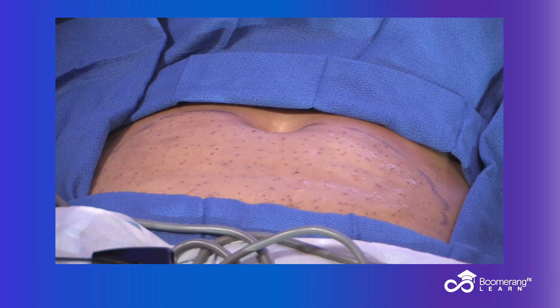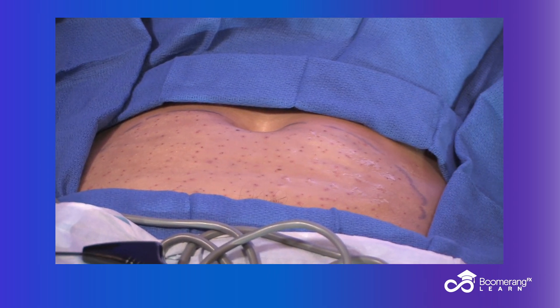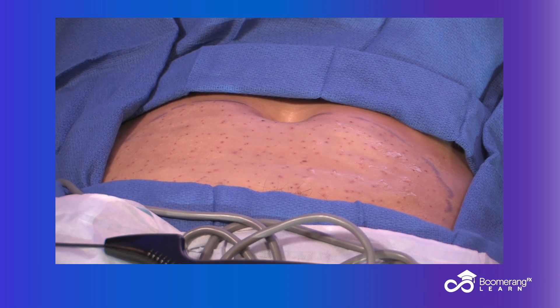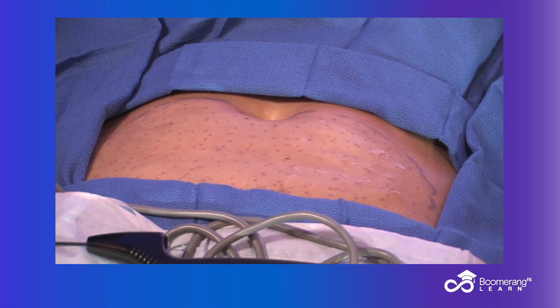This is the most uncomfortable part — giving them those sticks. When you ask the patients, they say that Meseram sucks, that thing hurts so bad. They don't say anything about your quantum. It's because they're totally sensate when you're doing the Meseram — they're not numb yet. So of course everyone hates the Meseram and talks about how mean it is. But they will not say much at all, if anything, about your quantum.